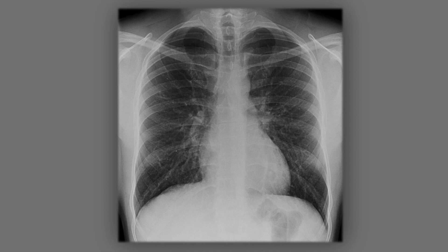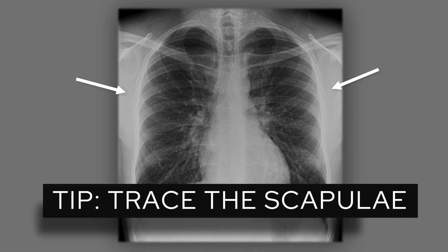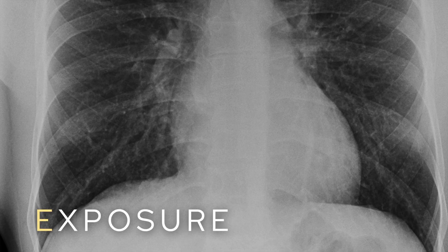The simplest way to tell whether an X-ray is AP or PA is to look for a label — that's the most reliable method. If there's no label, look at the scapulae: if they are out of the way of the lung fields, some attempt was likely made to move them, suggesting a PA film. If the scapulae overlie the lung fields, it's either an AP film or a PA film where the patient couldn't cooperate. It's good practice to trace the scapulae for pathology and to avoid mistaking a scapular edge for a pneumothorax.